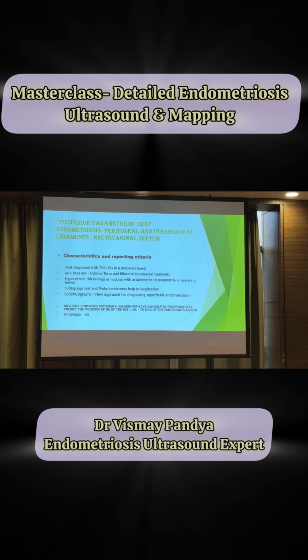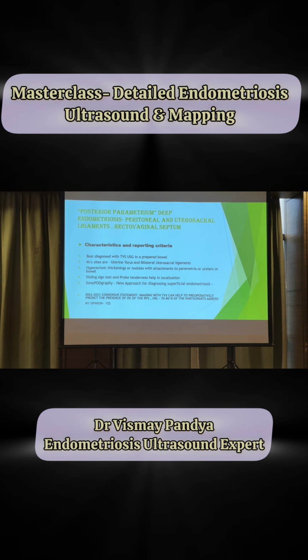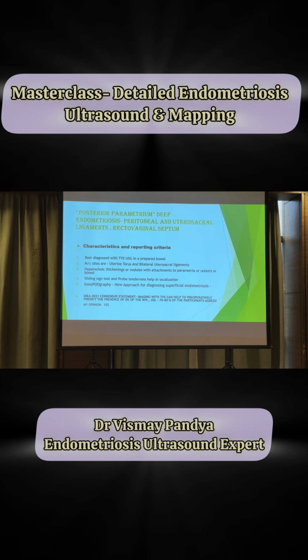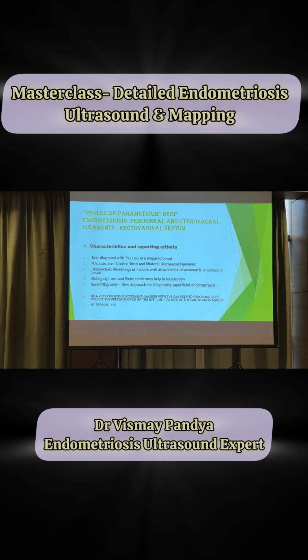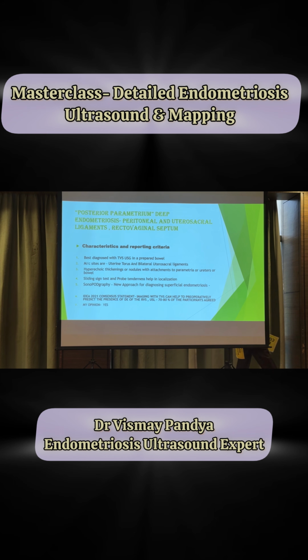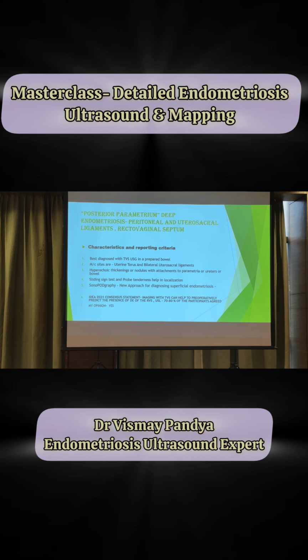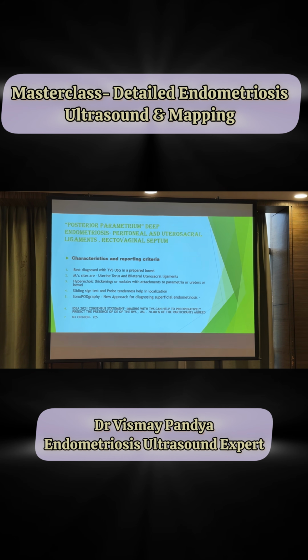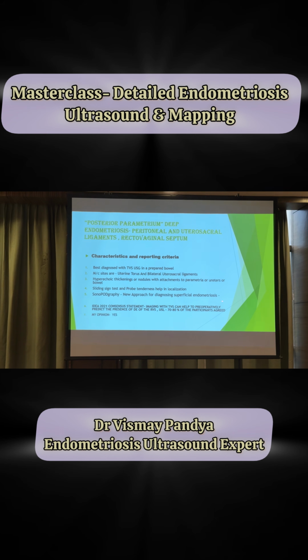So it's very simple. You do an SSG. You already know that your tubes are patent, and you make the patient walk for some time. After 15-20 minutes, you will see that there is this fluid collection in the POD. That fluid collection will act as your contrast gel, or it will make that distended, and you can see all the peritoneum. You can see the uterosacral. You can even see the rectal serosa, and all very small hypoechoic dots or nodules can be easily picked up.